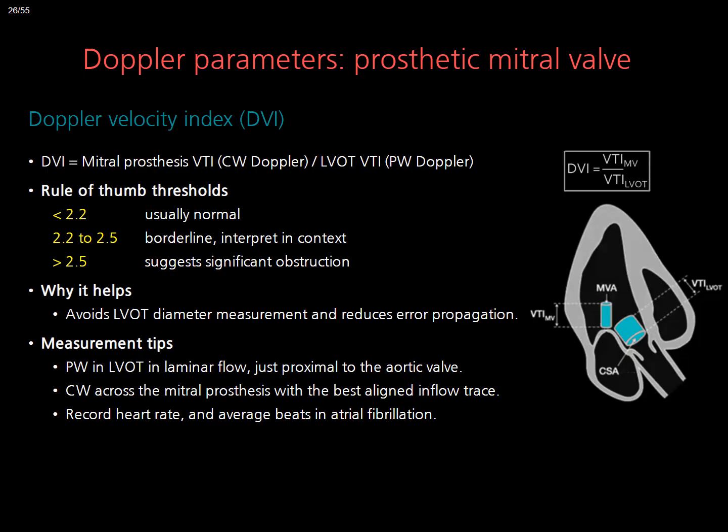Borderline values need context, especially heart rate, flow state, and the presence of significant mitral regurgitation. As always, compare with valve-specific reference values and the baseline post-operative study.